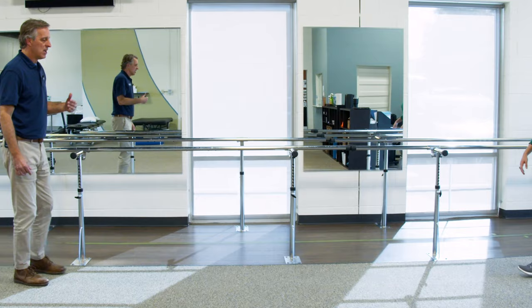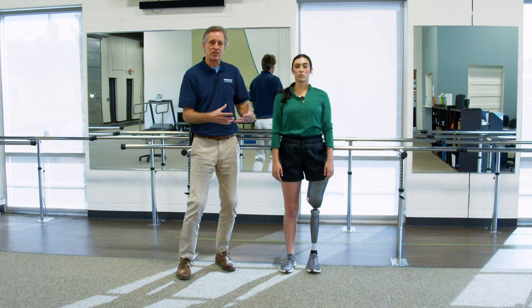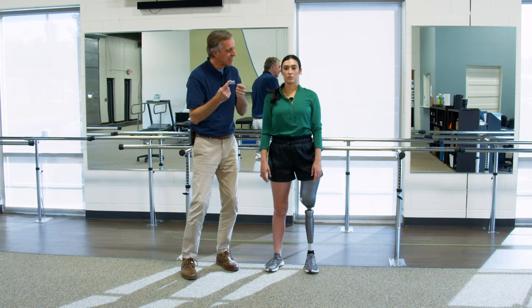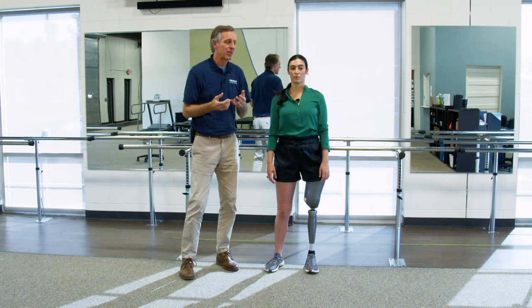So what we've got with Tracy is the idea of walking through with confidence and then putting her in all different positions. Sideways, backwards, crossover step, and forward long step, short step, and all that on command. Because at that point, she starts to stop thinking. We know it from athletes. You get to a point where you get in the zone, and you almost stop thinking about it, and you just play. And once you've got those basic skills, you want that in life. You don't have to think on every step in life. You want to start to relax a little bit and let it come to you.